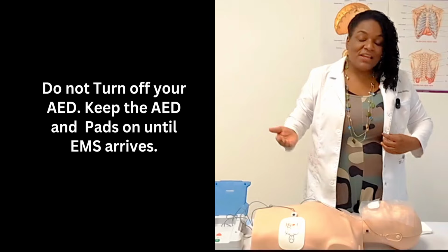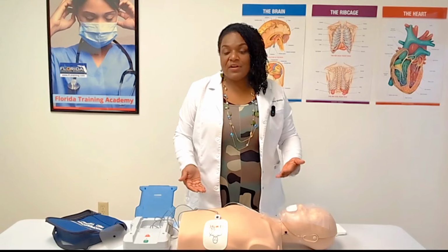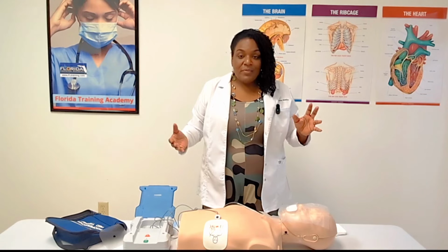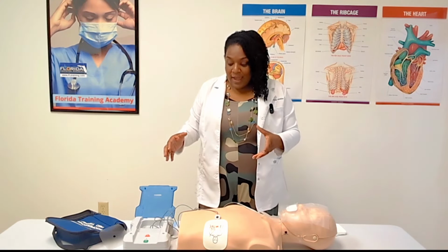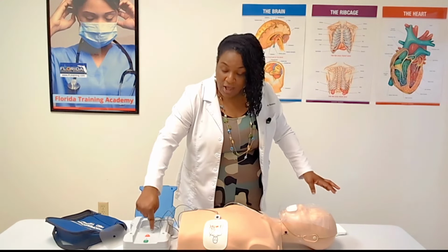And you continue doing that until the AED reanalyzes. And the AED is going to reanalyze every 2 minutes, at which time you want to say clear, allow the machine to run its program. It's checking to see if the person has a shockable rhythm. And if they do have a shockable rhythm, you repeat the steps. Whenever it indicates, make sure no one's touching, you would press the shock button.